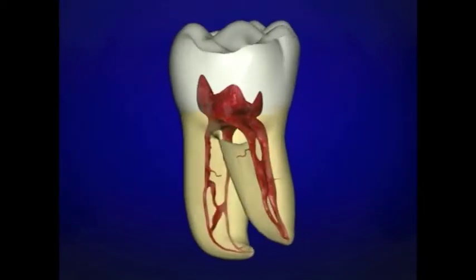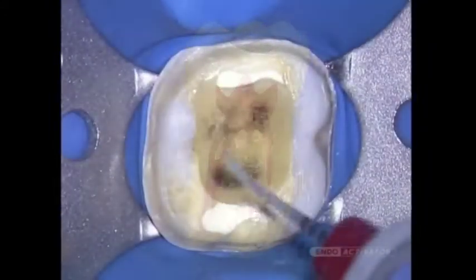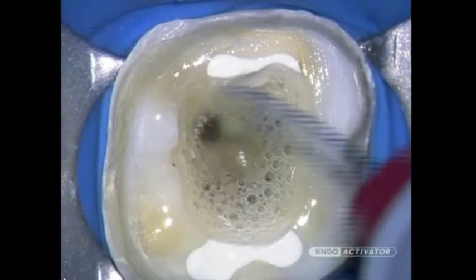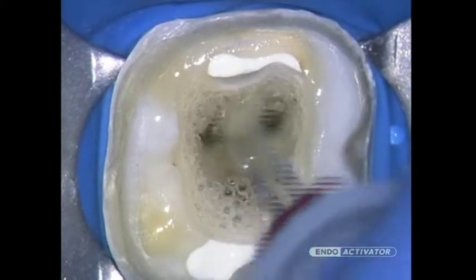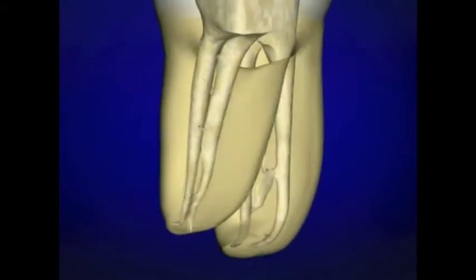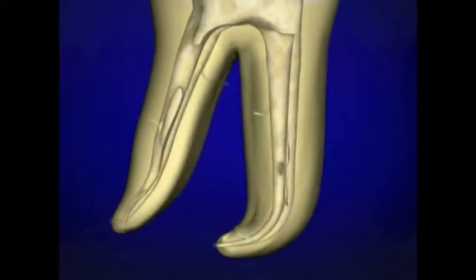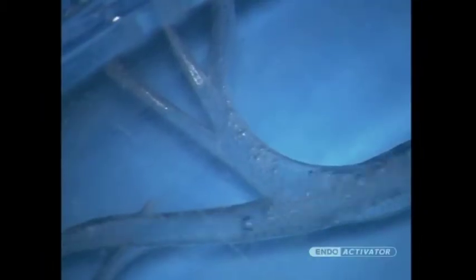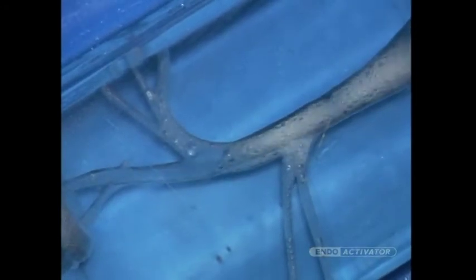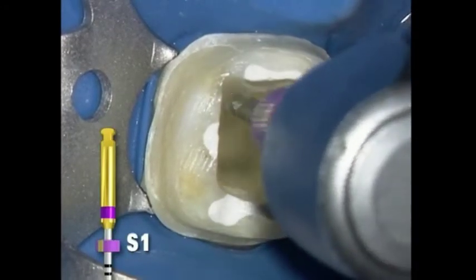There is increasing endodontic evidence to support that fluid activation in well-shaped canals plays a strategic role in debridement and disinfection into all aspects of the root canal system, including lateral canals, fins, webs, and anastomoses. Importantly, there is great interest in the role of the hydrodynamic phenomenon to disrupt the smear layer and biofilm. Logically, a cleaned root canal system promotes three-dimensional obturation and long-term success.